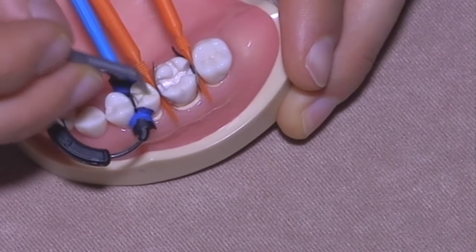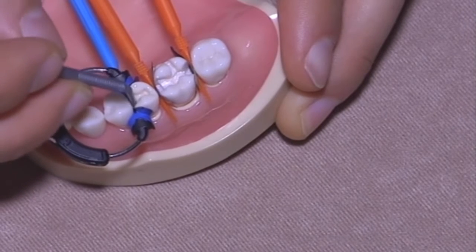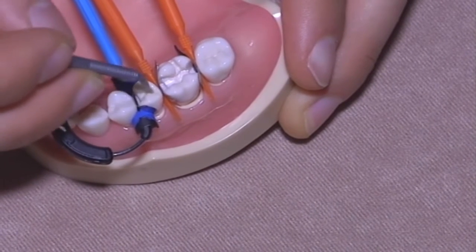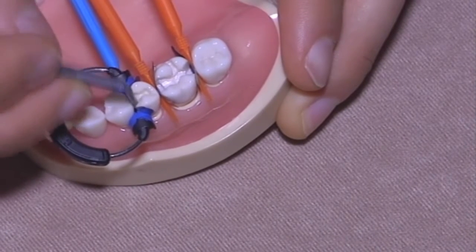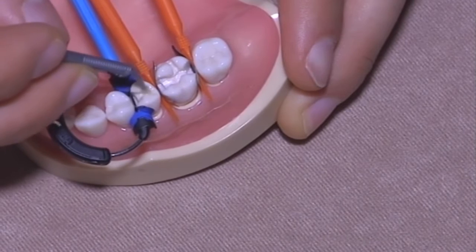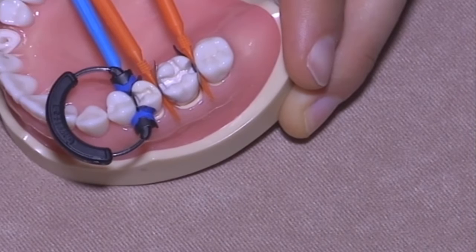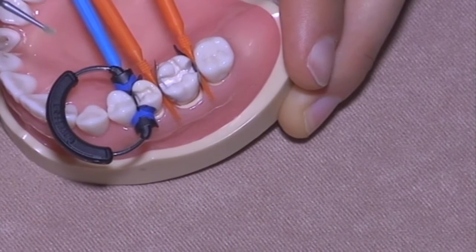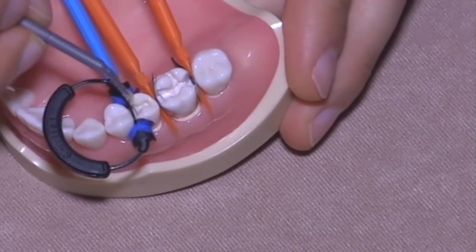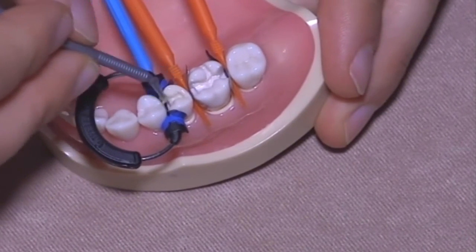The only thing you have to do is to brush. It's better to waste 10 seconds more on this step instead of performing the restoration again because the patient is in pain or you have infiltrations. So in this case, you apply your bonding, then you dry it with air. I can blow. Don't do that, really, please. And then you brush again.